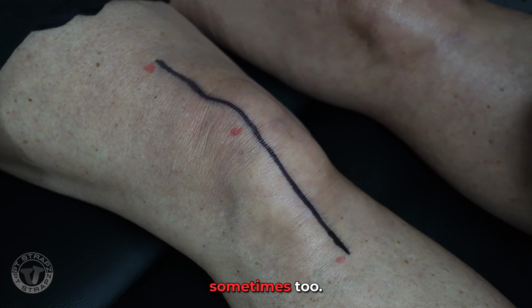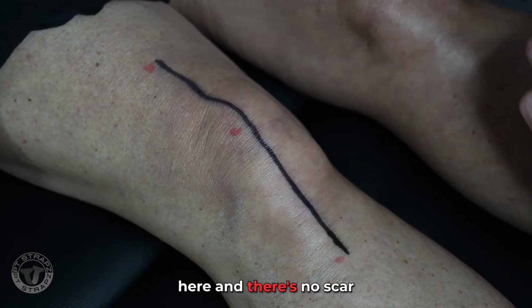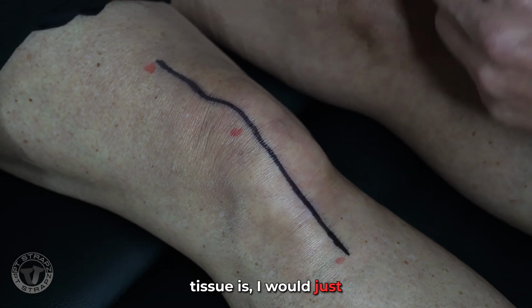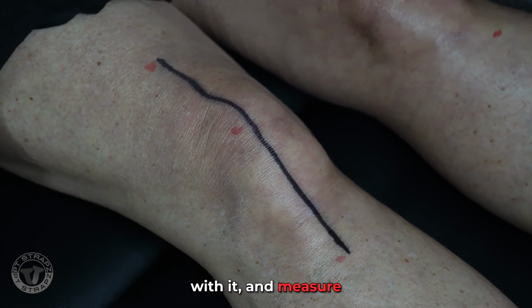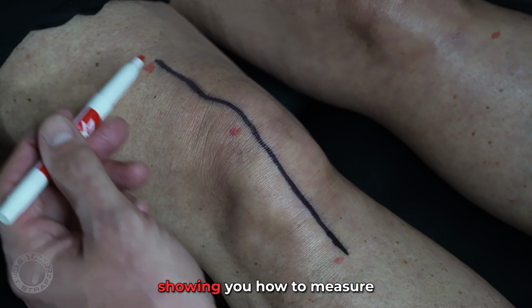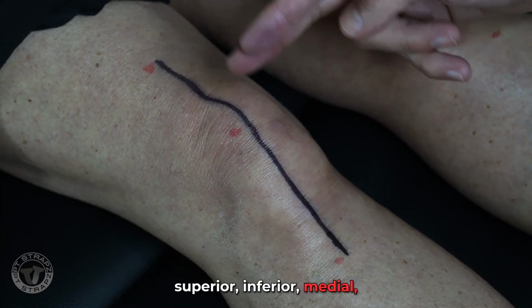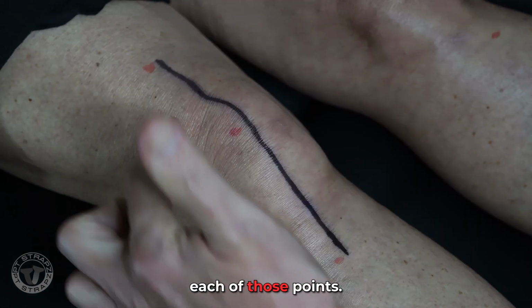I recommend sometimes too, let's say they have a massive scar here and there's no scar here. If you want to see what their normal tissue is, I would just do some spots that would be somewhat parallel with it and measure those to give us a normal value. However, for our purposes, we're just showing you how to measure the scar. So that gives us the superior, inferior, medial, and lateral aspects of the scar excursion in each of those points.